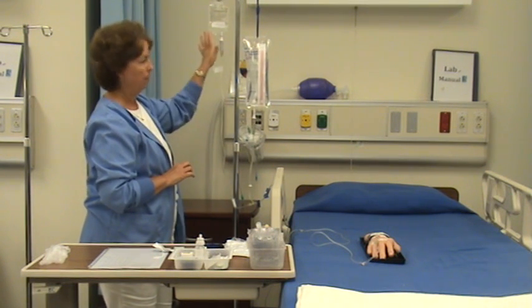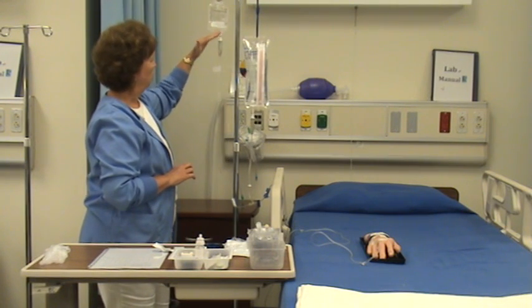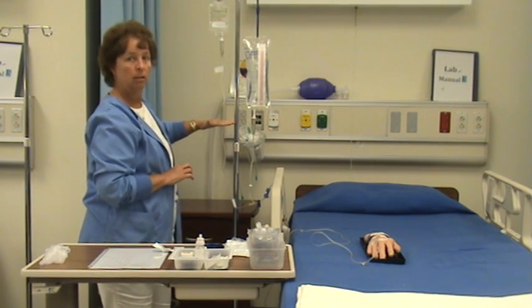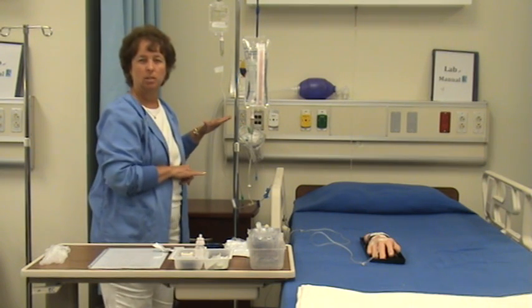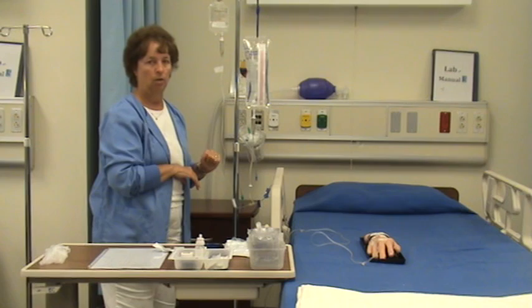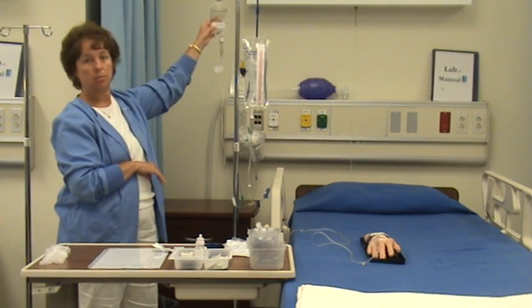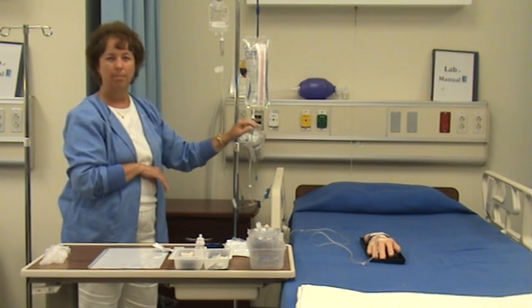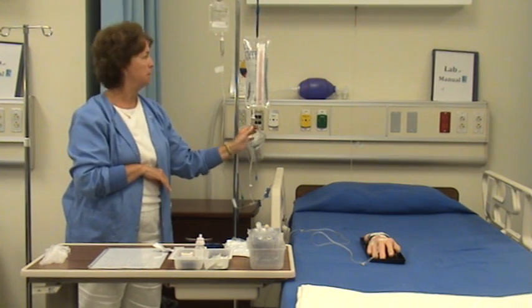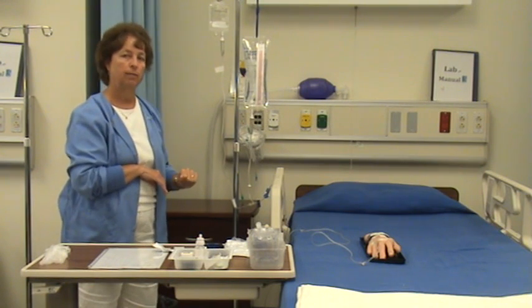This is not running while that's running because of the way the pressure is. The pressure's up here. Once that fluid comes down to about here, this is automatically going to start dripping. So your IV does not stop after this is done. This one will just take over. But it's going to take over at the rate that you set this one, which, if you remember, this was at 16 drops. This was at 33. So this is going to be going twice as fast.